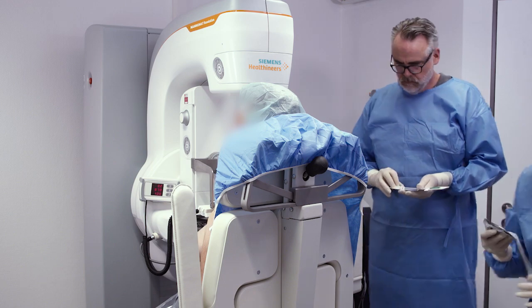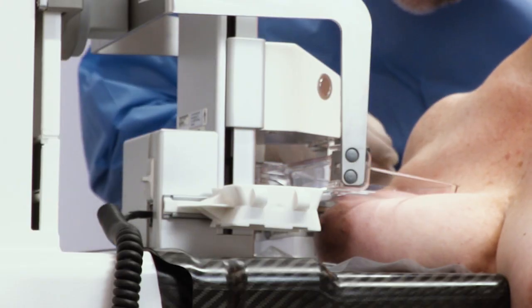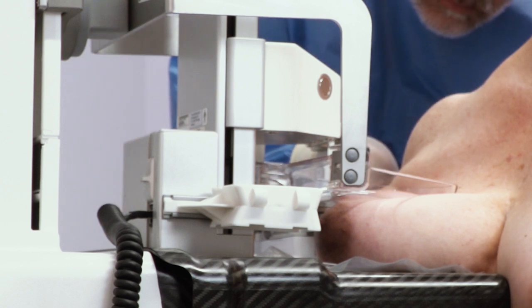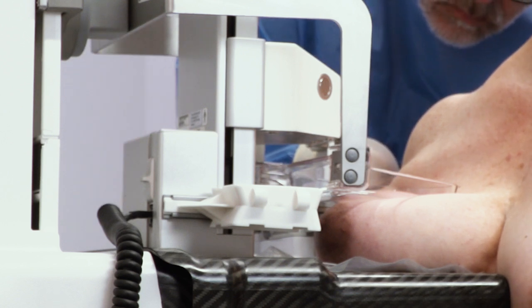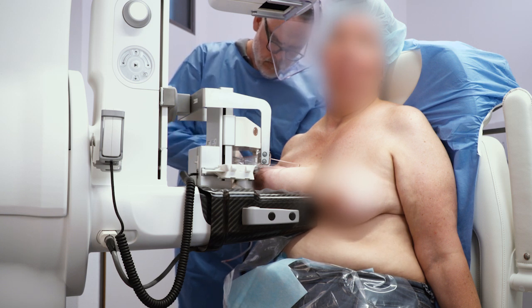If necessary, we mark the area with a clip. This is a case where we were able to completely remove the calcs. We would then have no other way to tell for certain where the biopsied area was. At the end, we take control images of the clip.